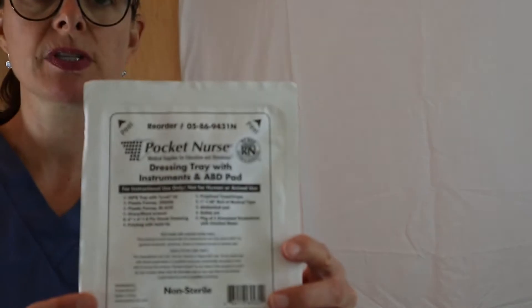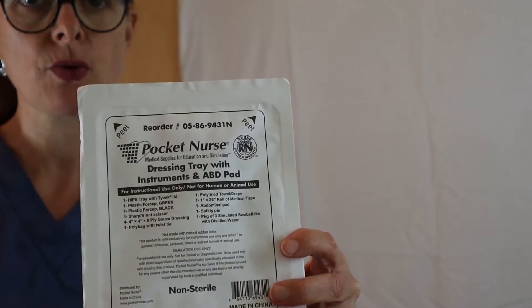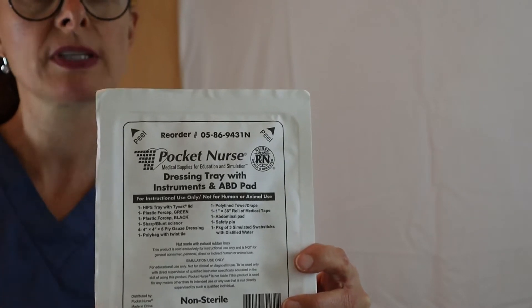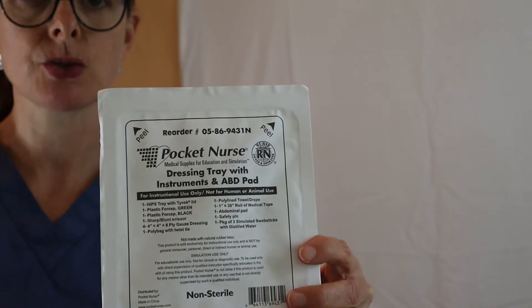Keep in mind if you're using a kit, it usually has all the contents listed right there for you so that you know what's in the package and then you can gather any other supplies that you might need.